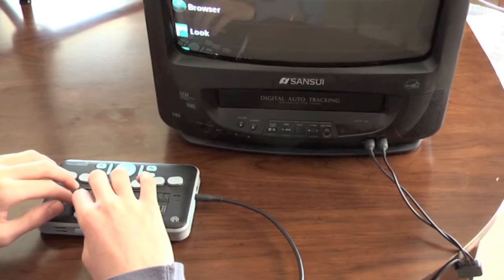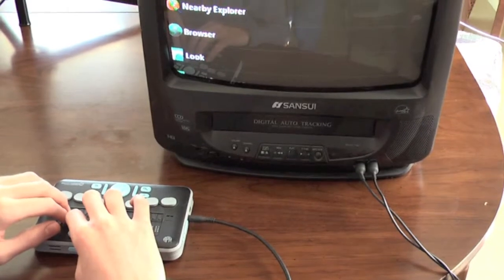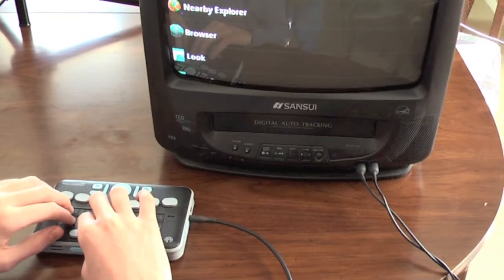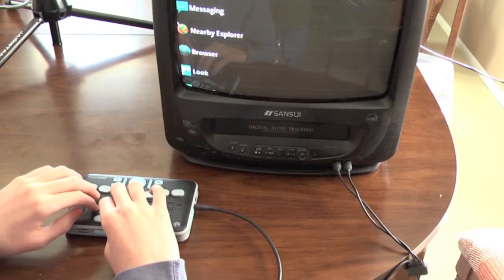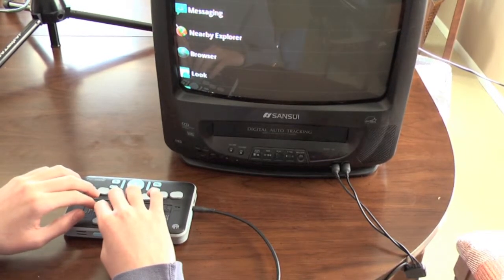And just remember, when you're using this menu or any other menu on the Braille Plus, as soon as you press the menu, you will need to use your left and your right arrows to navigate through that menu. And then any menu you access after choosing an option from the main menu after pressing the menu key, you will access with the up and the down arrows.